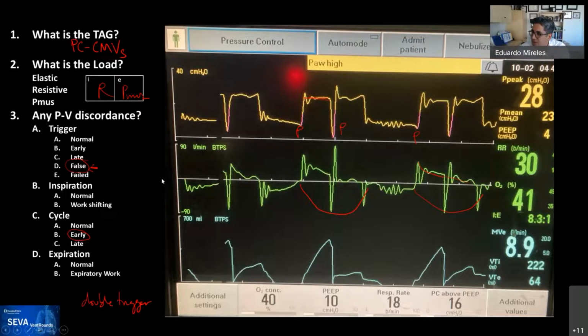Yes, it does. Just because it's a COPD patient, as you're mentioning, setting a long I time is kind of the opposite of what we want to do in these patients. But okay. Very good. And sometimes what they try to do here is set a pressure trigger, and you just set it high enough so that the patient cannot do that.